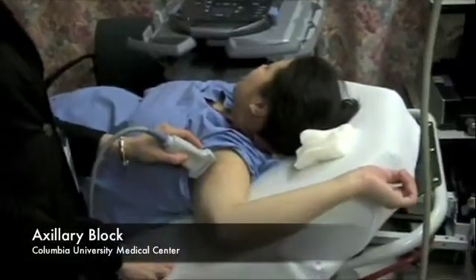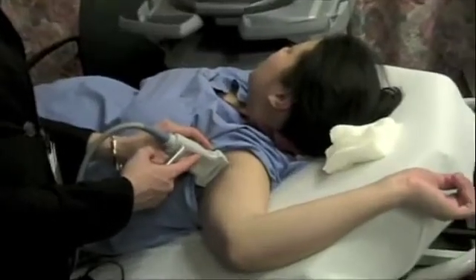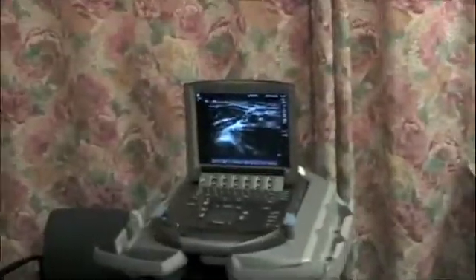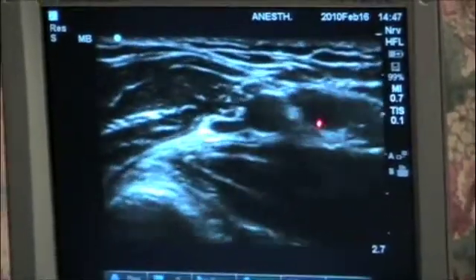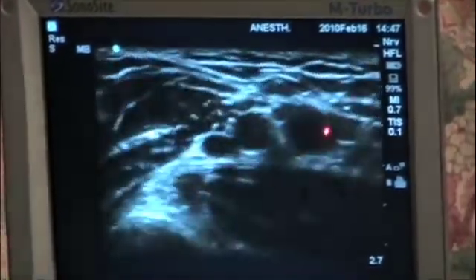For forearm and hand surgery, when we're doing this with ultrasound guidance, we can place the ultrasound probe high in the axilla. We can notice here that the axillary artery is this structure, and the axillary veins can also be quite easily compressed with the ultrasound probe, so it's very important to be aware of this.